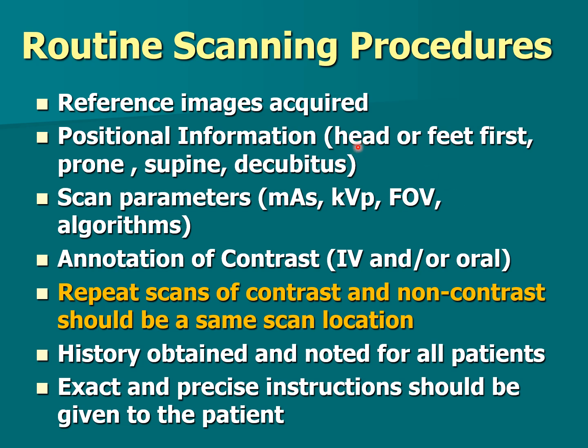It's going to let them know if the patient is going in head first or feet first, because that makes a difference if it's the right or the left side you're viewing. It's going to have the information if the patient is prone, supine, or decubitus. Again, this is usually pre-programmed. Almost always the person goes in head first and they're going to be supine, but that is not always true.